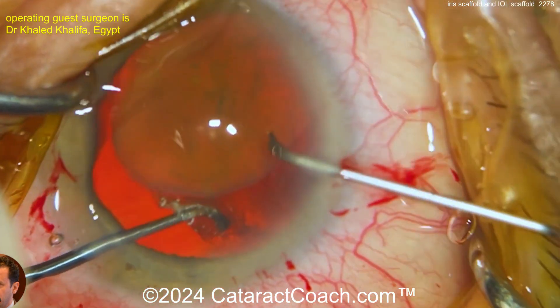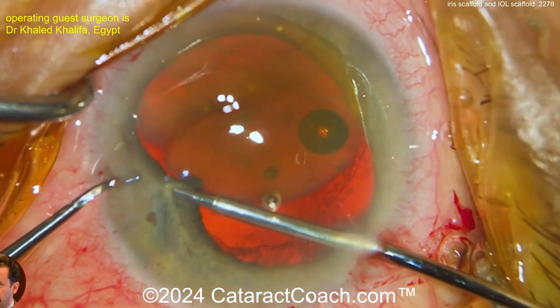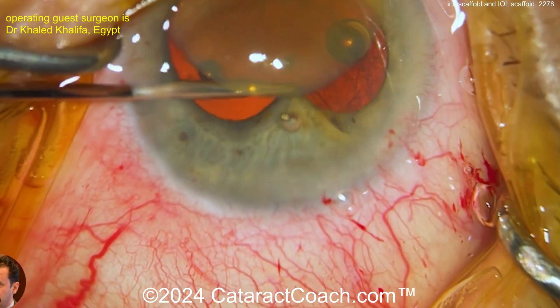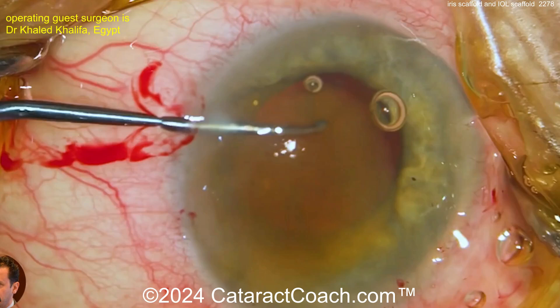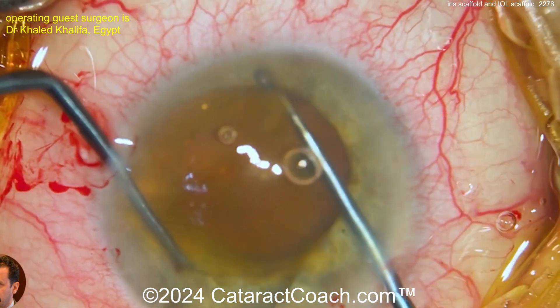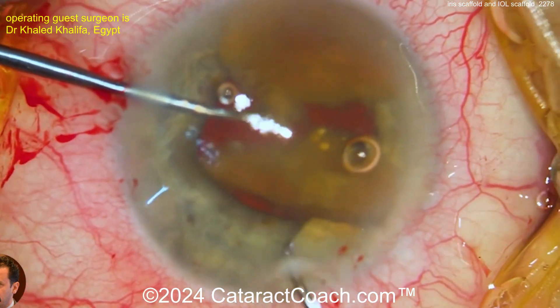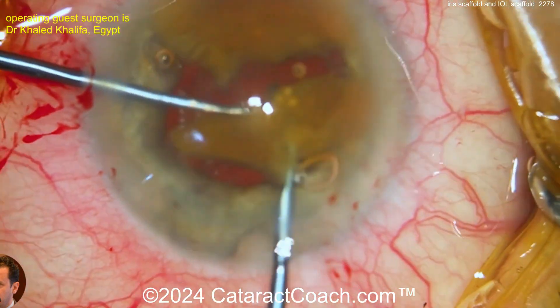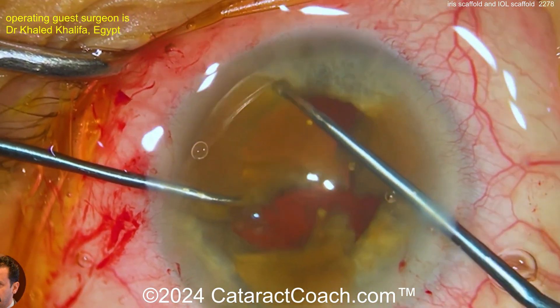A ball tip chopper in one hand, a different kind of bent needle in the other. Now look at this — bringing the nucleus above the iris and pulling the iris, what I like to call the manual miotic maneuver. Grab that iris and bring it in to make the pupil small so you can help support that lens nucleus. Now chopping it in two halves so you can get it emulsified in the anterior chamber. Breaking it up into quadrants in the anterior chamber using those two choppers.